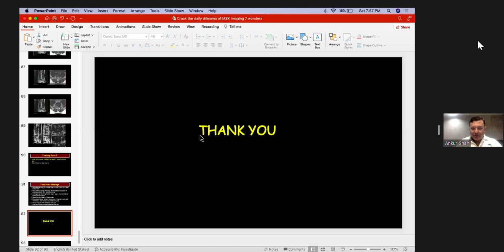Can posterior root tears of the medial meniscus be missed on arthroscopy? Root tears are usually seen because that is one area which they can easily see, because it is in the intercondylar region. We need to look carefully on MR not to miss those root tears, because if the meniscus is not extruded, then on sagittal image it might be just one image where you see that torn root. It is just like the ghost sign, where you are seeing the meniscus and suddenly in one image the meniscus disappears. So look carefully on MR.